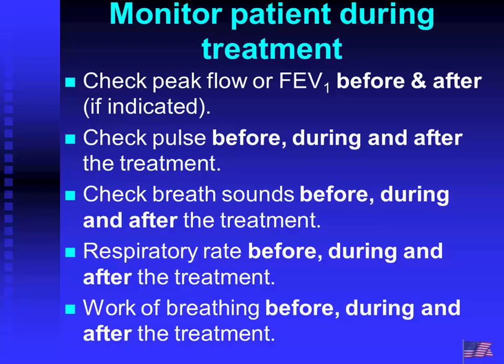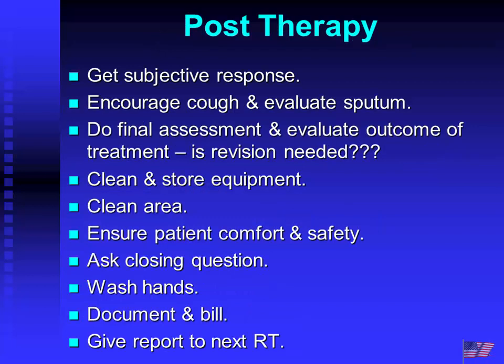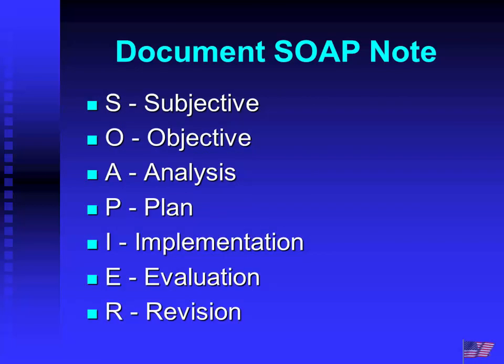Again, monitoring the patient, we talked about the same thing for the MDI as there was for the SVN: before, during, and after. Doing, again, patient education, optimal time. Looking at the subjective response, and again, specifically if you're using peak flows or some other mechanism of pre and post. Subjective relief. Documentation.